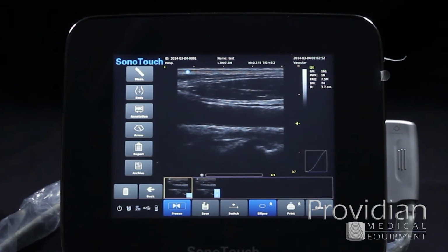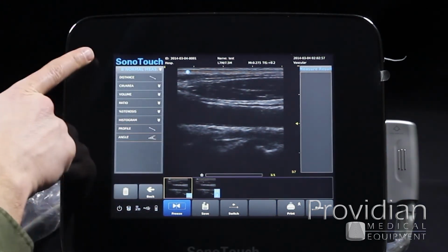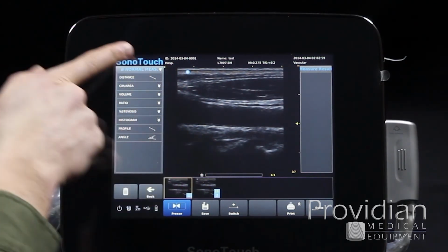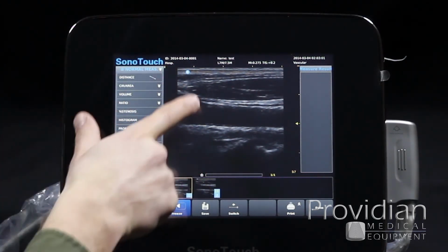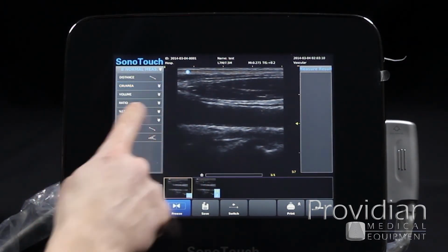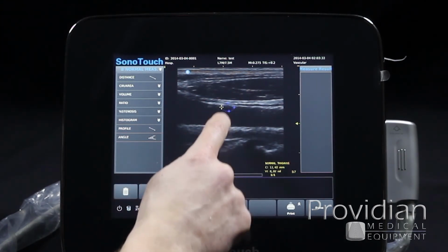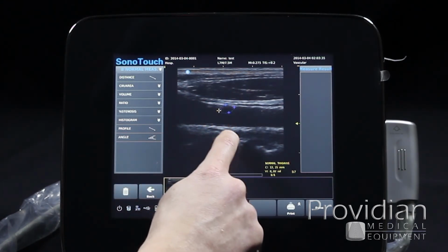Now if I want to use the calculation package, I'm going to hit Measure. And this will ask me what I want to choose. I have the two arrows which show that there are submenus beneath there, how I want to measure various items. I would take this measurement, say I want a 2-axis volume. I'm going to click here.